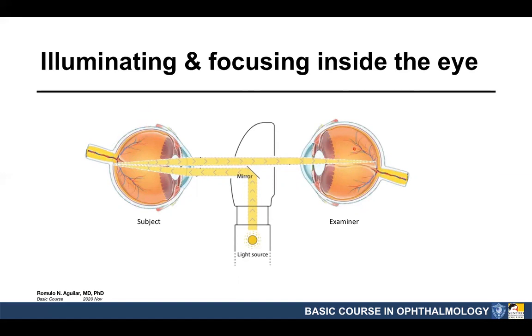So this gets reflected back into the observer's retina, but then there are limits to how much the lens can accommodate. In a very short distance, the distance might be too near for the lens to compensate. So what has to be done? You put additional lenses to compensate for the lack of accommodative power of the lens in working for close distances. And this is actually the principle or the concept behind the ophthalmoscope.